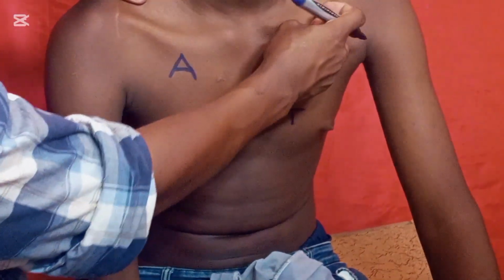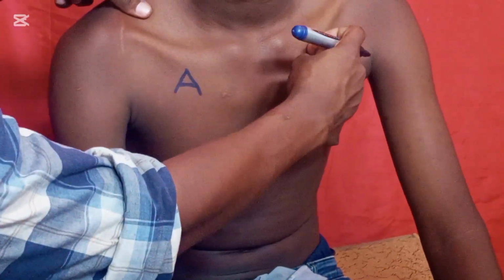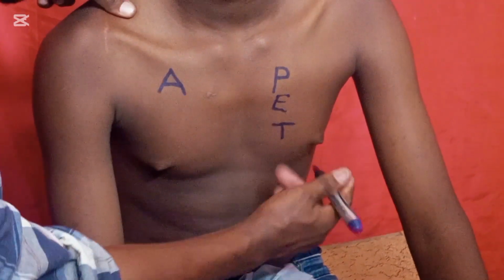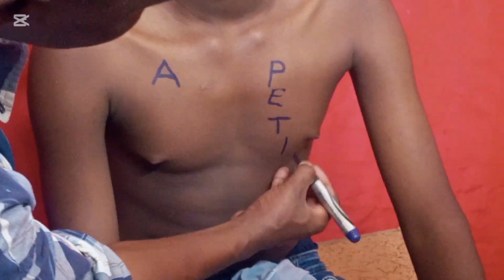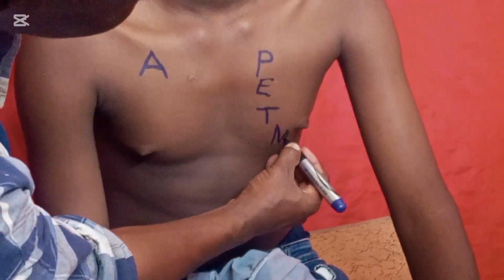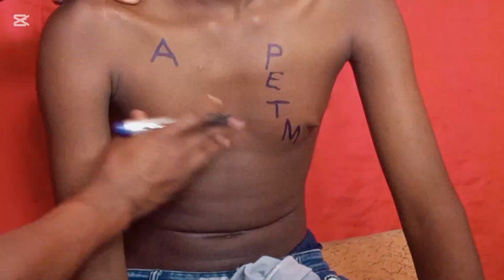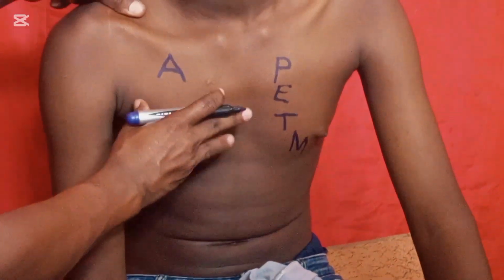Then in line with the midline of the clavicle, you move down to the mid-clavicular line. So here is where we find the mitral valve. So this is how you are going to locate the areas where we're going to listen to the heart sound.